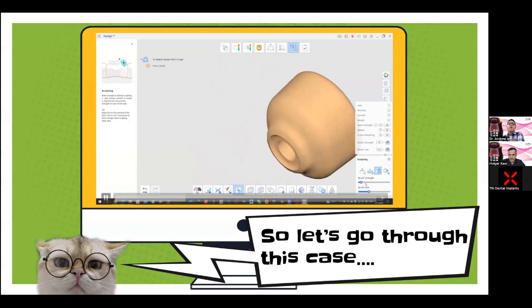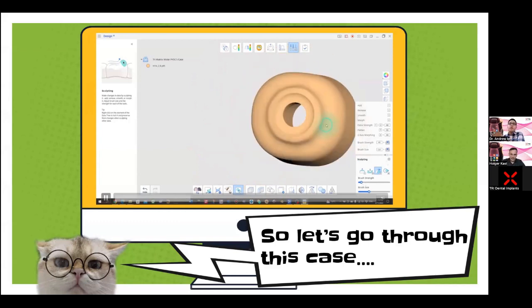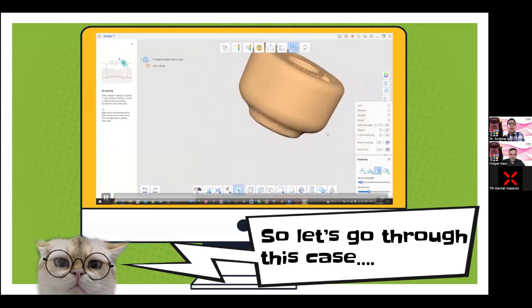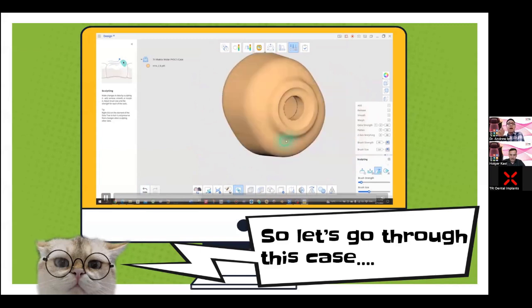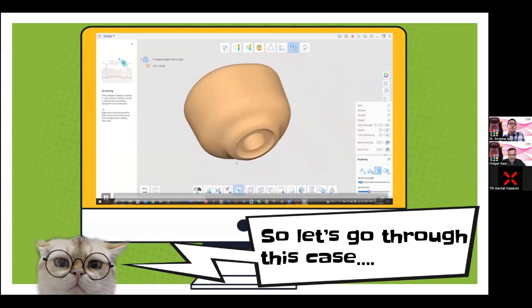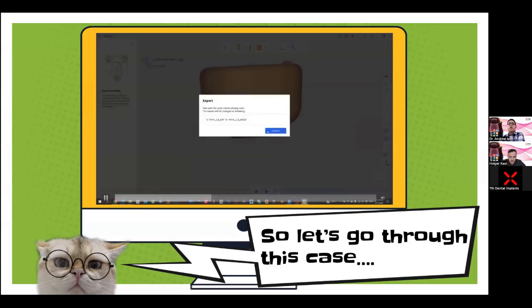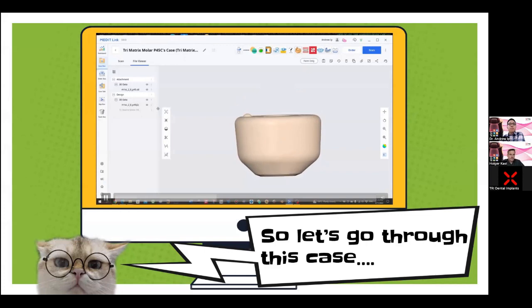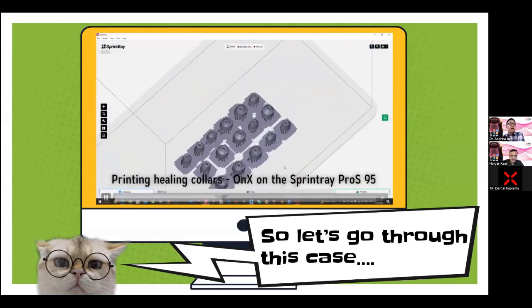And that's the beautiful thing about 3D printing. You can print 3 of these, 10 of these, or even just one of these, and the print time remains the same, because the print time is all related to the actual total height of your print, rather than how many objects you have on your print bed. That's why we'll see in the future printing will very quickly become more popular than milling in certain applications.